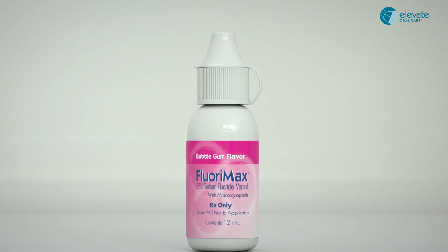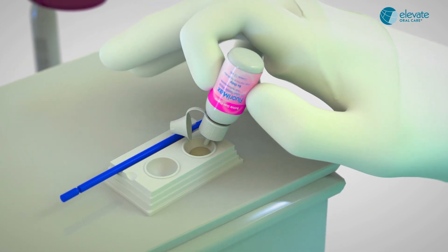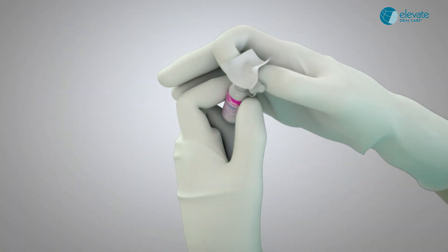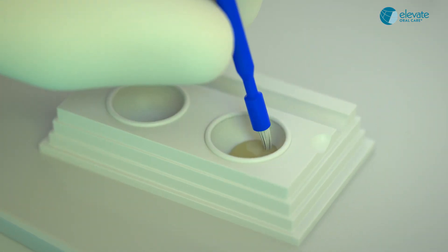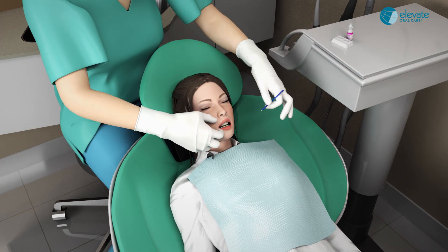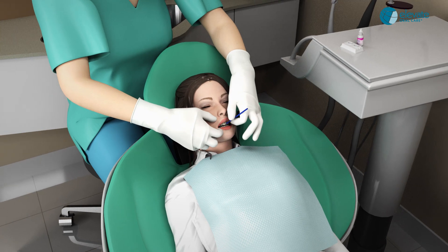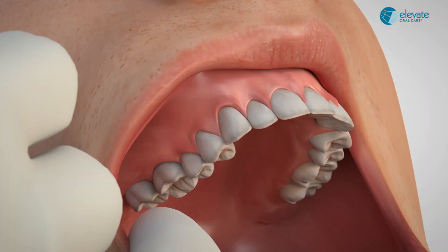Close the flip-top lid. After dispensing, any unwanted or excess varnish on the dispensing tip can be wiped away with an alcohol wipe. Then dip an applicator brush into the dispensed varnish. In all application processes, keep the teeth moist. Dry mouth patients may even benefit from a brief spray of water.